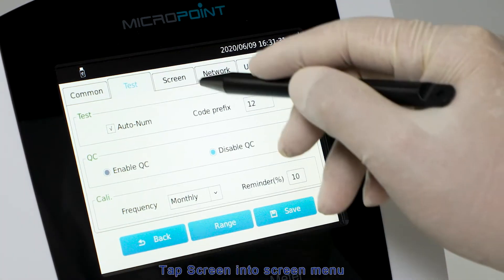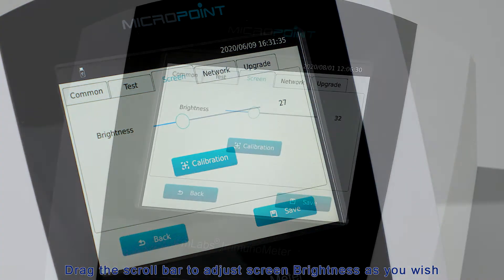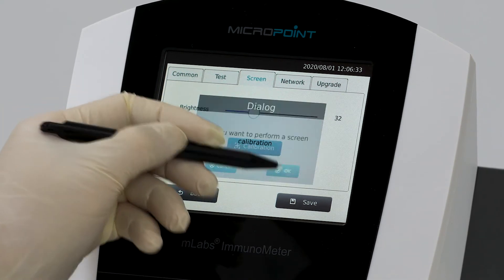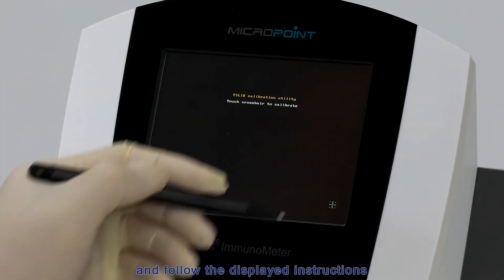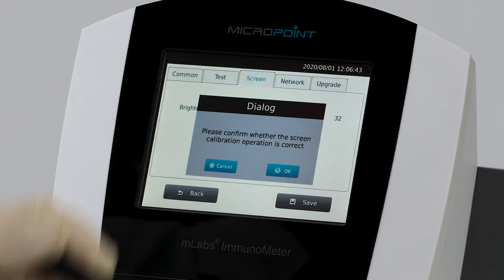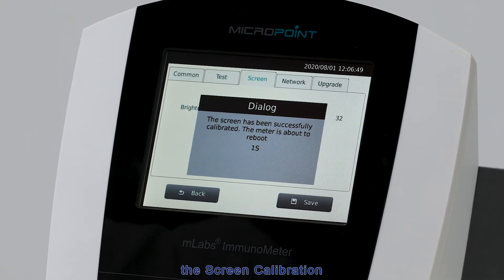Tap Screen to enter the screen menu. Drag the scroll bar to adjust screen brightness as you wish. Tap the Screen Calibration button to calibrate the screen, then select the crosshair cursor and follow the displayed instructions. The system will automatically restart after screen calibration.